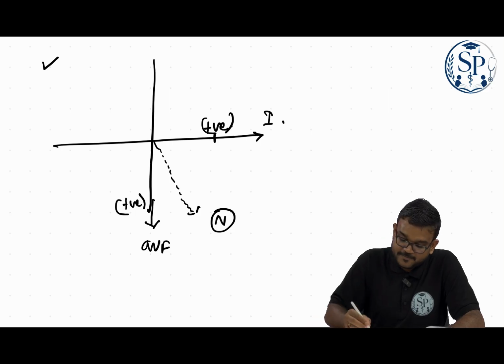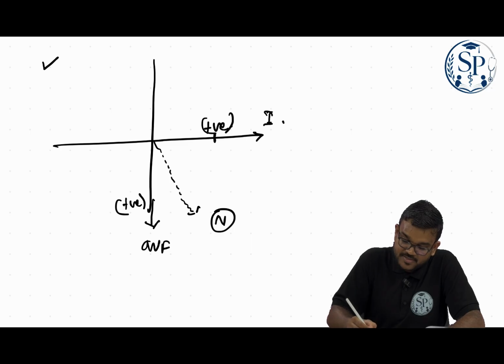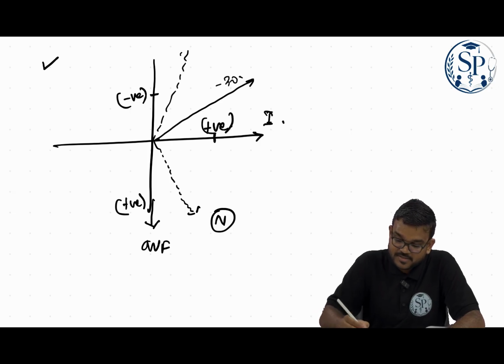Okay, suppose the R minus S is positive in lead 1, whereas the R minus S in AVF is negative in this direction. So the resultant may fall beyond minus 30. So this is left axis deviation.